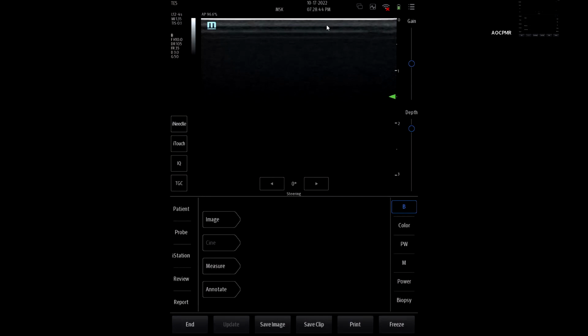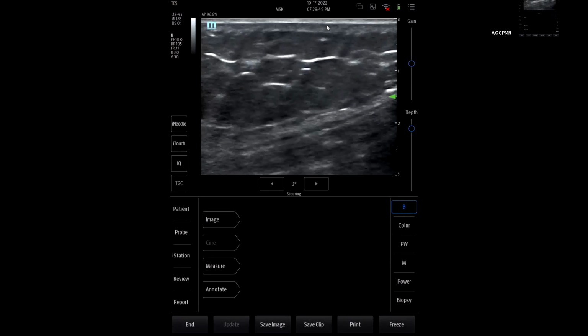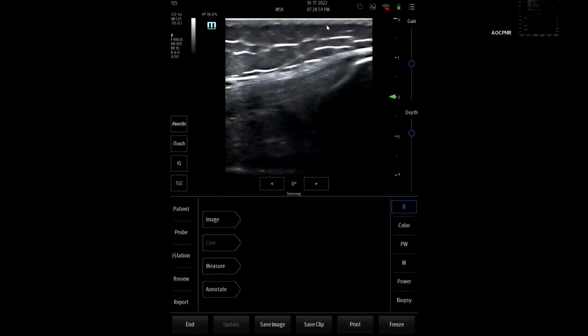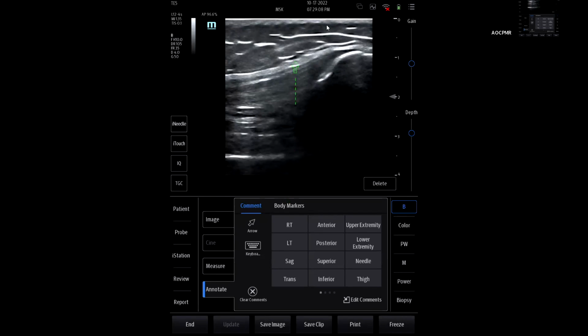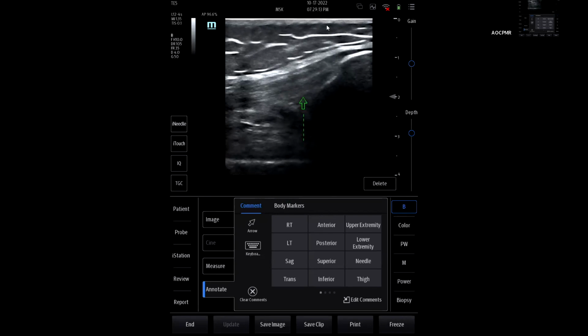I'm going to get some ultrasound jelly. Here we go. Let's increase the depth of this just a tad. There we go. Over here, we're going to have the patella, and you can tell by the shadowing, you can tell by the quadriceps tendon, the femur is down here. We can penetrate the view all the way down. This is prefemoral fat pad. This is suprapatellar fat pad, and you can see the creeping of that suprapatellar recess already.